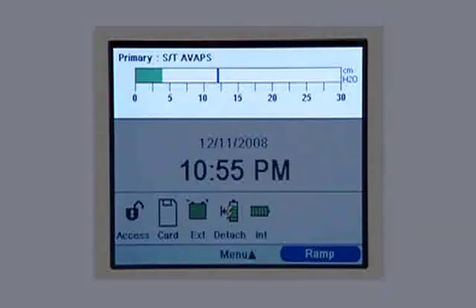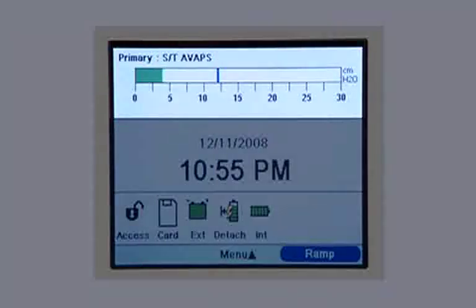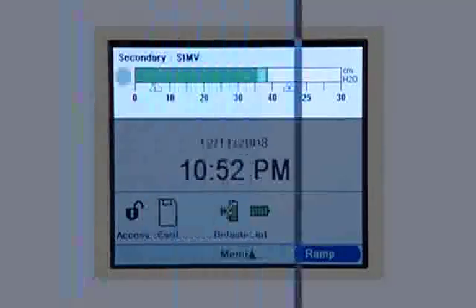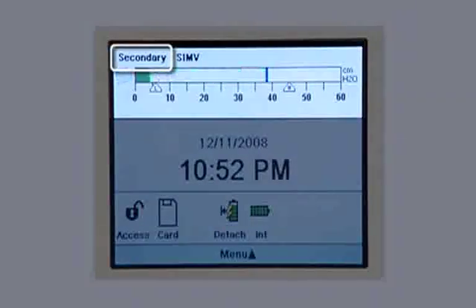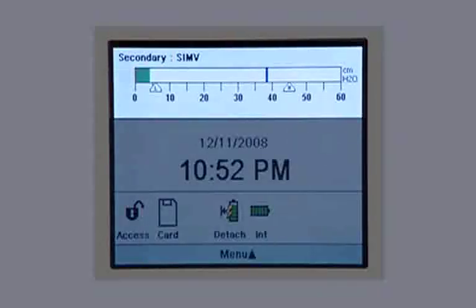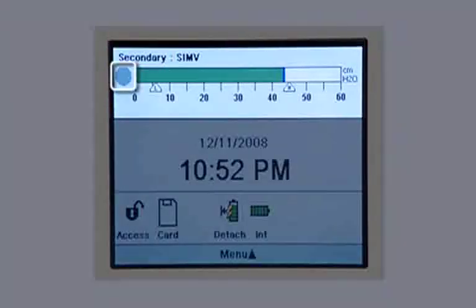If the physician has ordered two different prescriptions — for example, one setting for daytime and another one for nighttime — you will see primary and secondary indicated. A patient breath symbol displays during a patient-triggered breath.